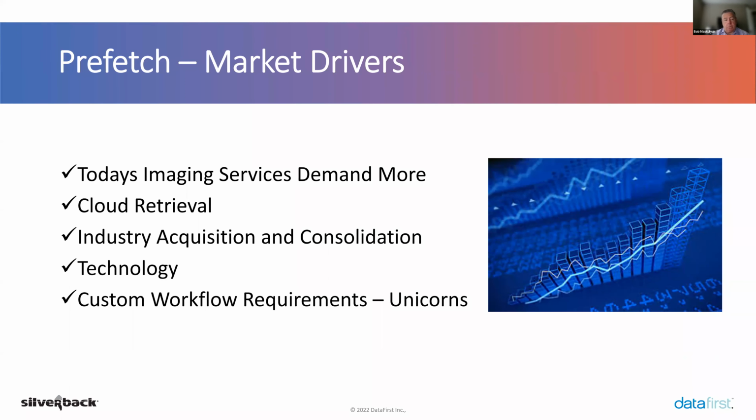And during those, you'll see radiology groups merging or cardiology groups melding together. And how do we get those exams in front of them before they've perhaps been migrated or ingested into a larger enterprise system? Prefetch is a great tool for handling that.